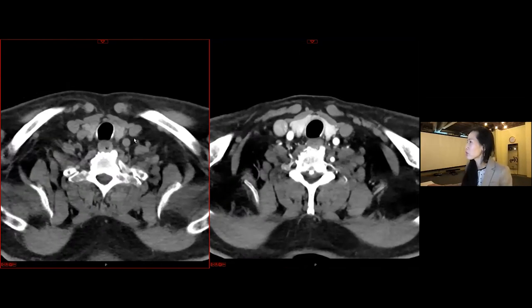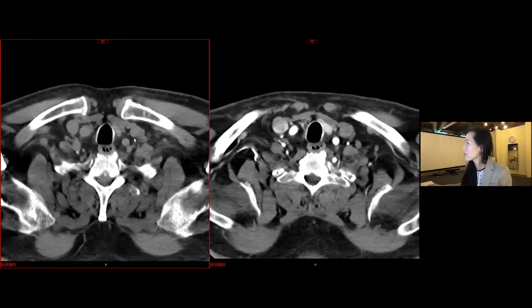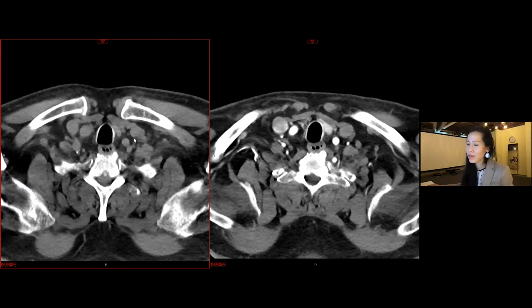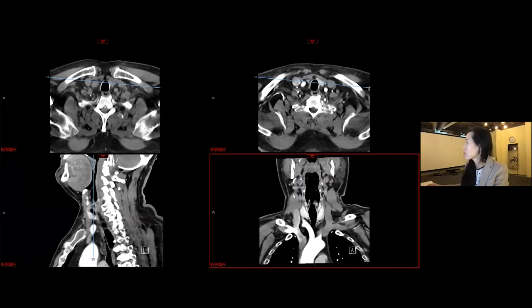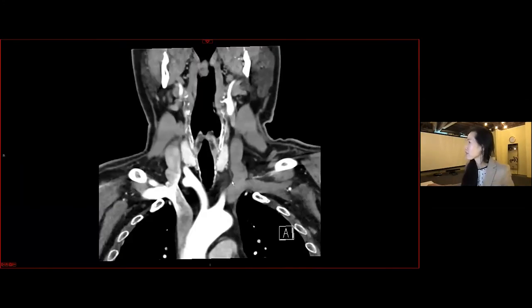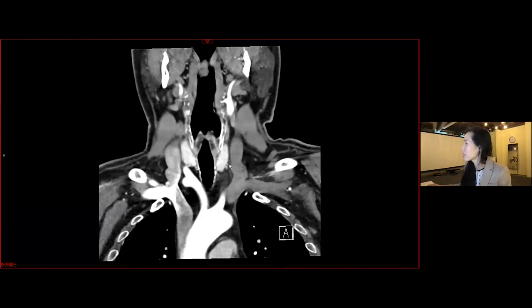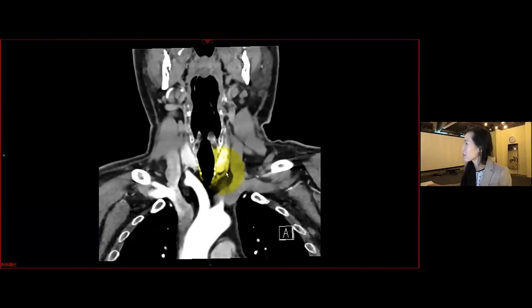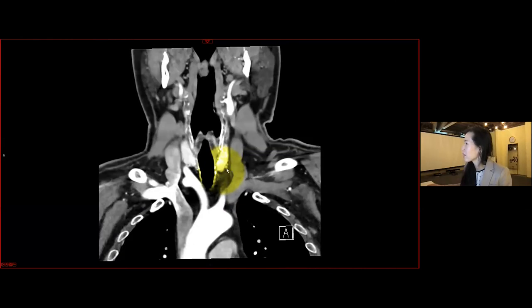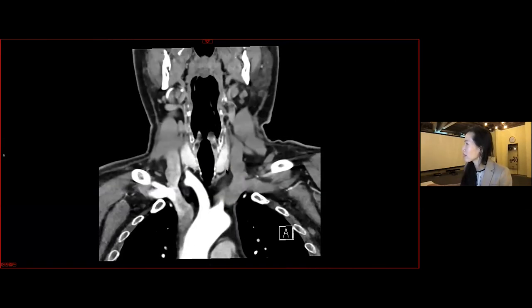So we've got two possibilities here, and this is where the other planes are very helpful. So let's have a look at the other planes. When we're looking on the coronal plane, the lesion that we saw on the left side actually ends up being vessels, and we can trace them.